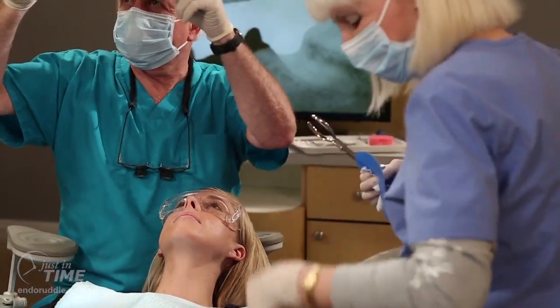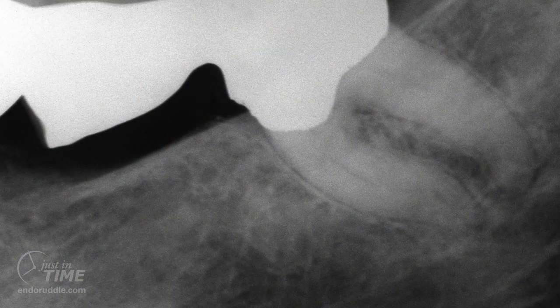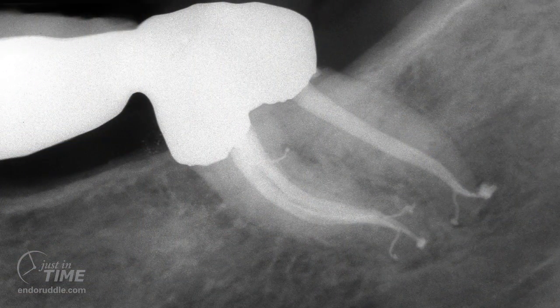I hope you've enjoyed watching this endodontic procedure that pretty much represents all the steps that comprise start to finish endodontics. To appreciate the postoperative result, let's review the preoperative film. Again notice the bridge and the orientation of the underlying roots. Appreciate that the canals are long, narrow and highly curved. Notice the furcal and apical lesions of endodontic origin. Notice in this particular instance, we've reprovisioned the bridge, we have smooth flowing shapes, and we have filled multiple lateral and apical portals of exit. When we look at the post-op film, it reminds me of the old expression — the thrill of the fill.